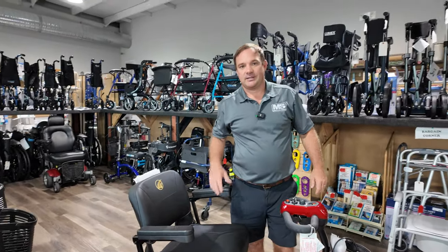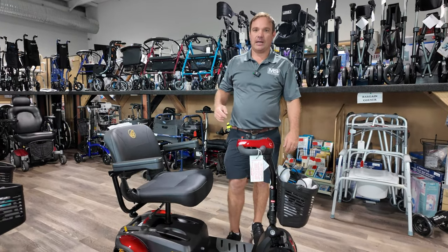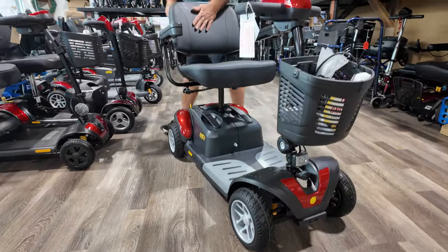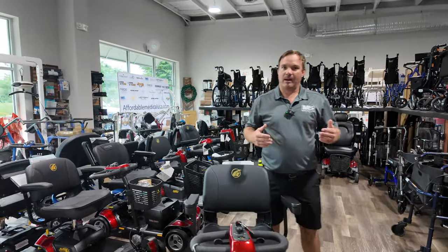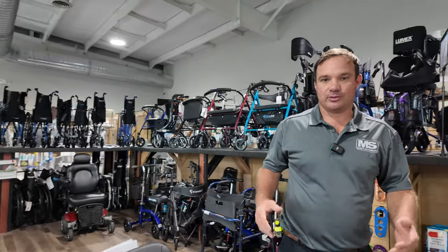I'm Chris with Mobility Solutions, AffordableMedicalUSA.com, and I have the Golden Technologies BuzzAround EX in the four-wheel configuration. This has been a very popular scooter — it's kind of like your SUV of scooters. You're going to need to pick up about 50-60 pounds because it is kind of heavy, but it does disassemble.